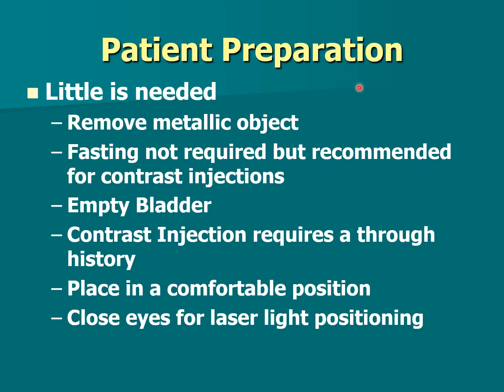Patient prep, very little is needed for the patients that are going to have spine, facial, or brain CTs. We obviously will remove any metallic objects that we can. Fasting is not required because we're usually not giving oral contrast, so we're not worried about the digestive tract. If you're going to give IV contrast, then sometimes we recommend fasting for 4 hours, just because sometimes that contrast makes people a little bit nauseated or ill. And so if they have an empty stomach, they're not as likely to get nauseated. Obviously, empty the bladder so that as soon as you get them on the table, they don't want to get off. Contrast injection requires a thorough history.